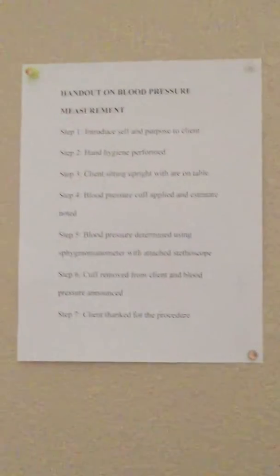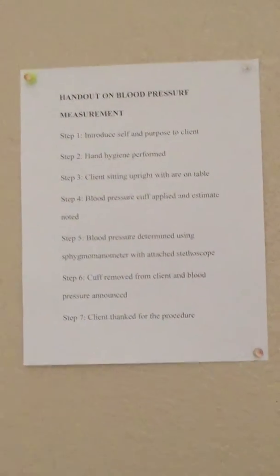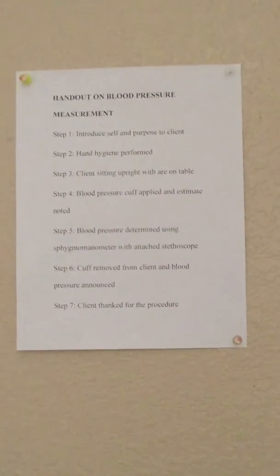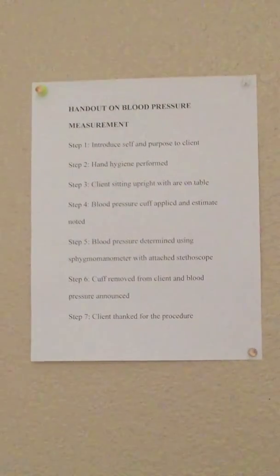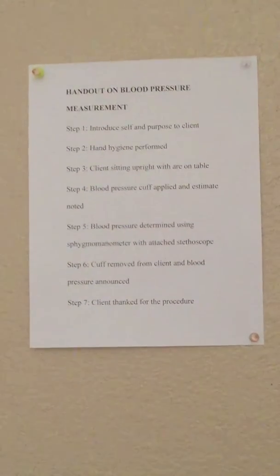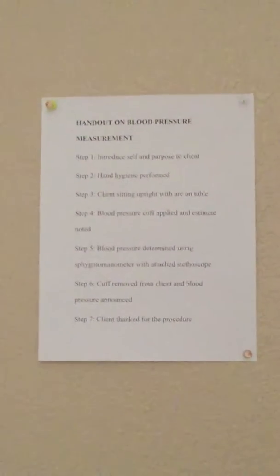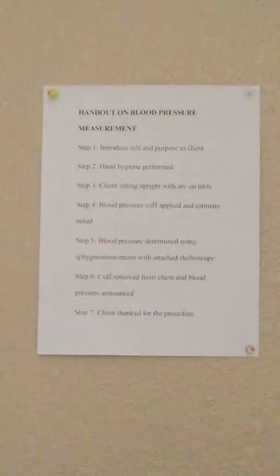The other thing we need to talk about is the proper procedure in which blood pressure is going to be measured. I have a link to a video clip that we are going to look at right now, and that video clip is going to show us the way in which blood pressure is going to be measured. So I'd like you to watch the video clip, and at the end of the video clip, I shall have you recite the order in which blood pressure is measured. And what is that order?